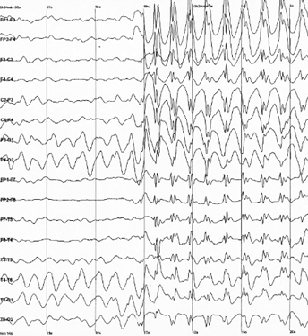EEG under general anesthesia depends on the type of anesthetic employed. With halogenated anesthetics, such as halothane, or intravenous agents, such as propofol, a rapid alpha or low beta, non-reactive EEG pattern is seen over most of the scalp, especially anteriorly. In some older terminology, this was known as a WAR, widespread anterior rapid pattern, contrasted with a WAIS, widespread slow pattern associated with high doses of opiates.